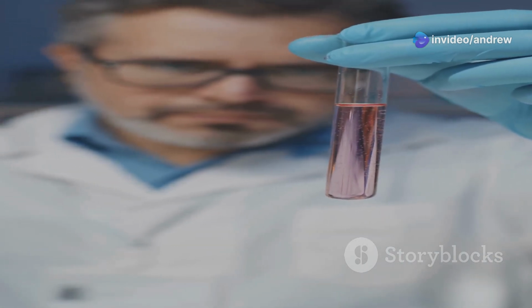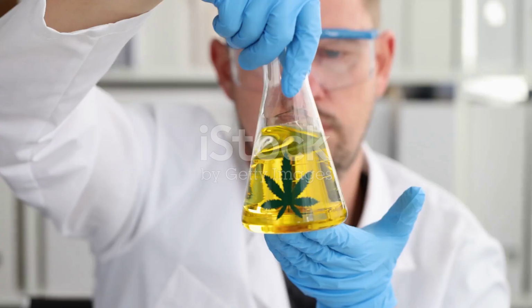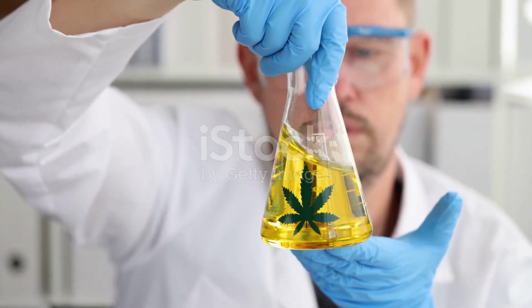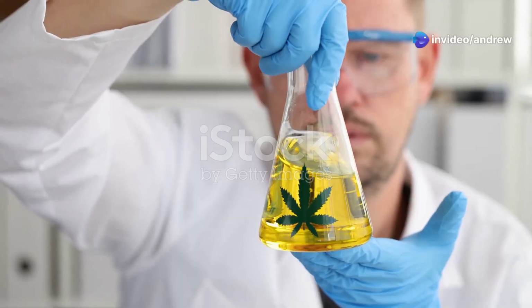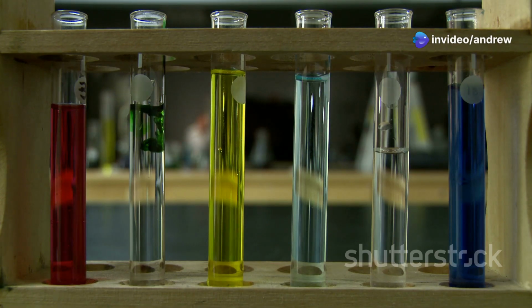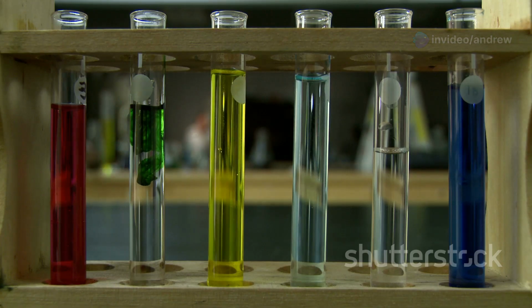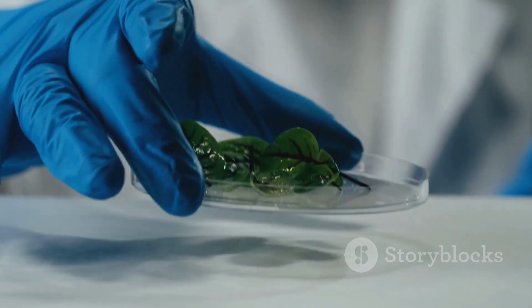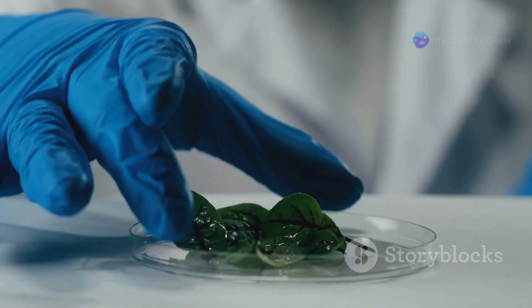Section 4. Understanding the Duquenois-Levine test. The Duquenois-Levine test is another color test used in forensic drug analysis, but it is specifically used to presumptively identify marijuana. Like the Scott reagent test, it relies on a series of color changes to indicate the potential presence of the drug. The test is particularly useful for detecting marijuana in plant material, such as leaves and stems.